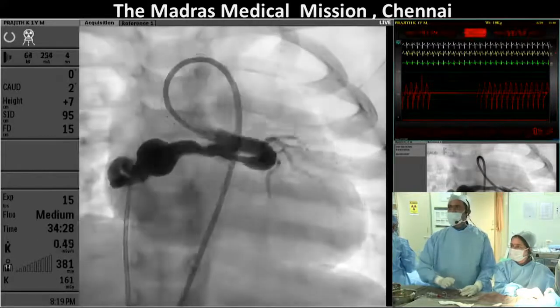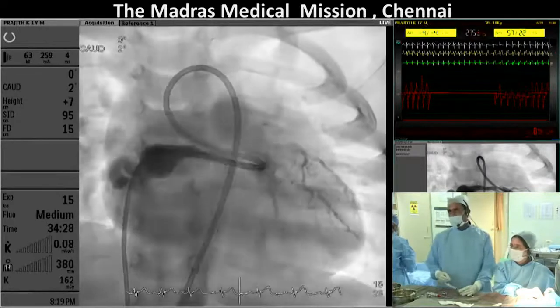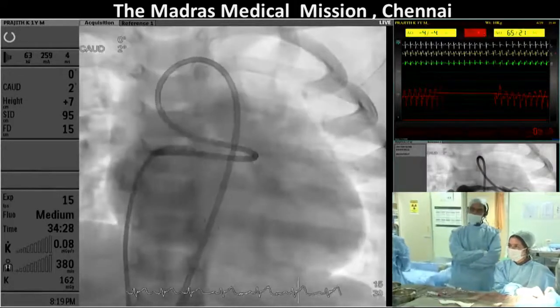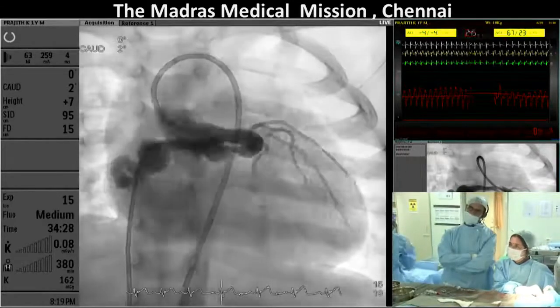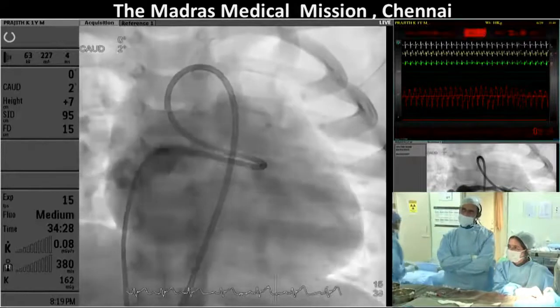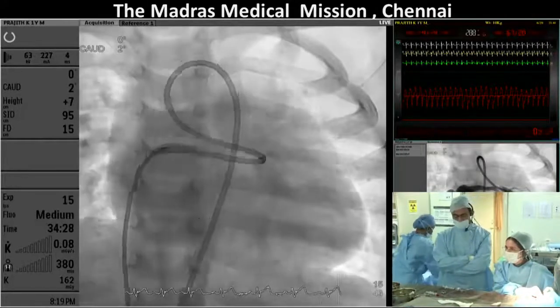Okay, Warren? Yes, definitely will close at the waist, I mean, before it's getting more dilated. I'll do it as Shiva said. I probably will go for AVP2 retrogradely at the waist. Mansoor? Question to Jim. You occlude the exits.